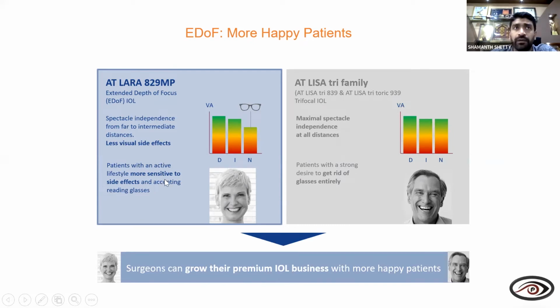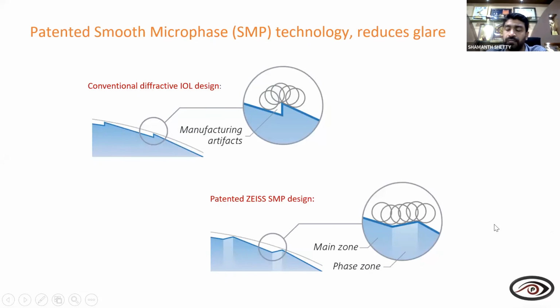No, because we are only promising the patient intermediate vision. But the best part is that we tell this to the patient beforehand, so we are reducing the patient's expectations. The patient knows that if they ever want to read printed matter, they would need glasses. That's the ease for the surgeon when it comes to EDOF, and it is also a little less expensive than trifocal lenses.